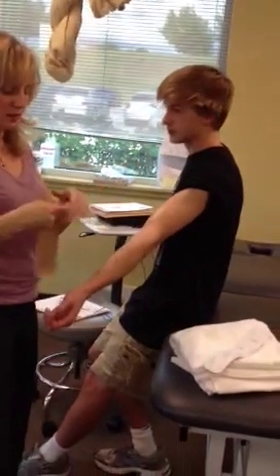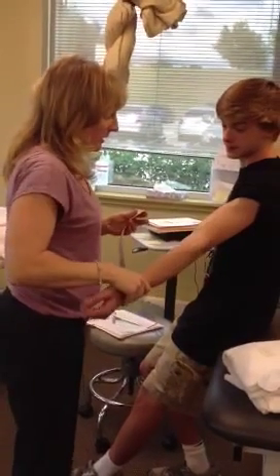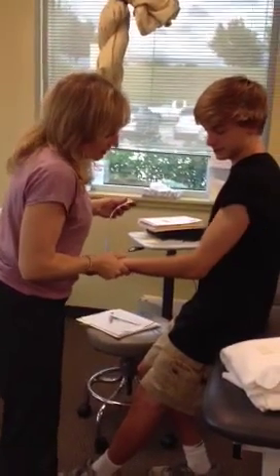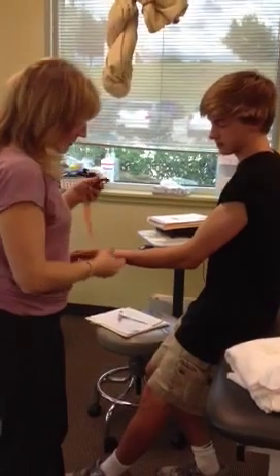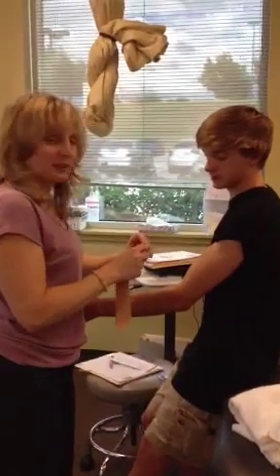All right, then I just tear it straight, and this is going to be my anchor. Now I'll relax the elbow, bend it to about 30 degrees — nice and neutral — and I start from the inside.